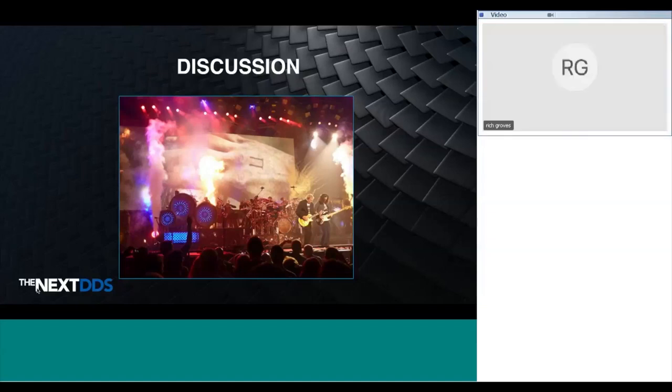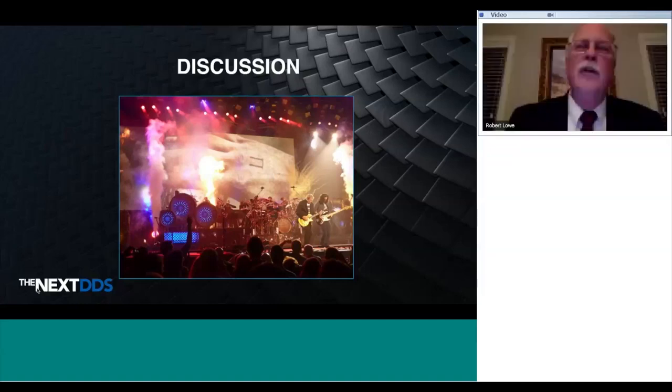What's your approach, your instrumentation? Is it a diamond that's your normal? What's your handpiece selection when you're cutting into a really dense material like a zirconia crown? Oh, you're talking about removing them? First, yeah. I pray to the zirconia gods, and then I take out an electric, because electric has constant torque.